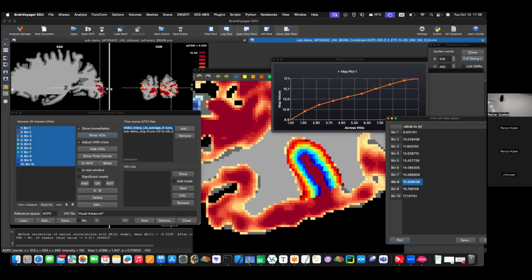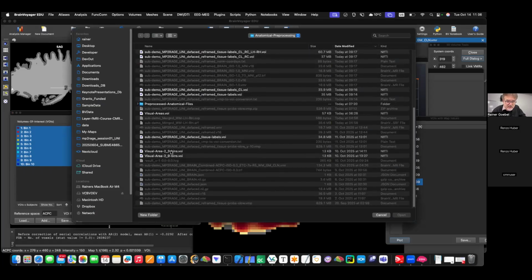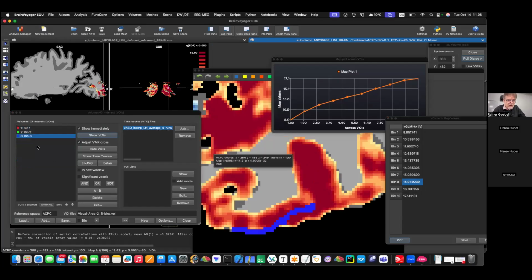So what I want to say is, the first voxels at the fringe of white and gray matter might not be used. But if I would run in 0.3 space with 80 gigabytes, or if I would not pick 10 layers but 7, I would have more. Yes, I actually have a version of this one for 3. I can also load this. So here, you have 3 bins.